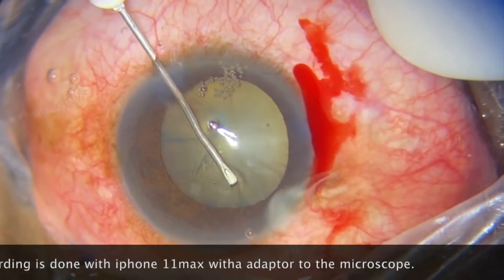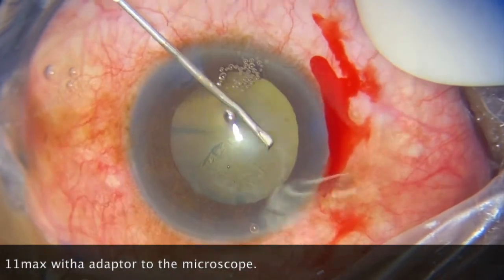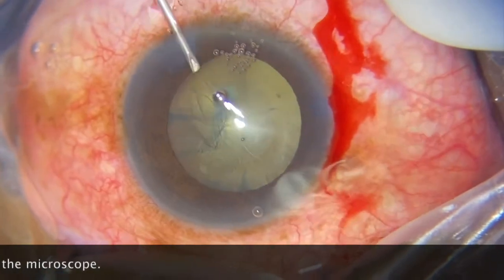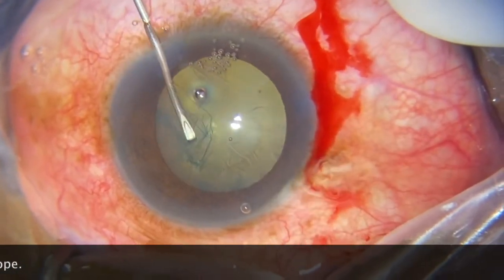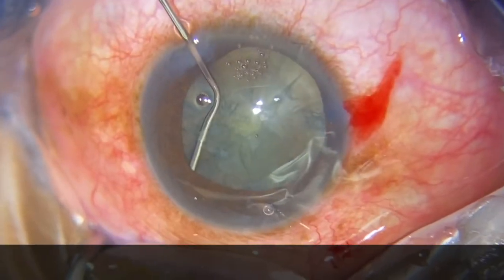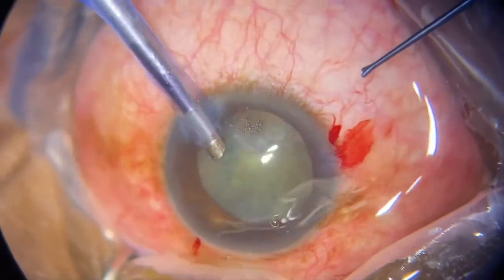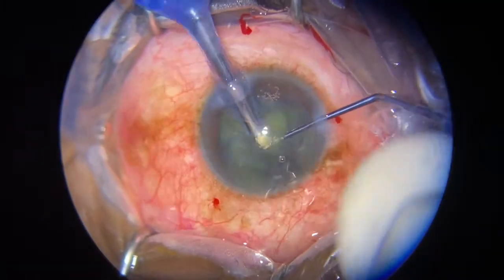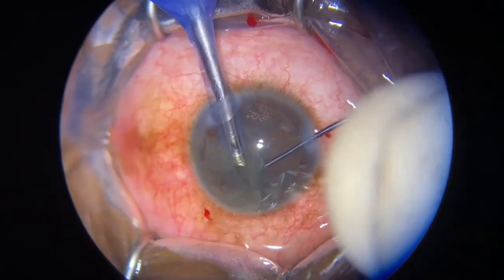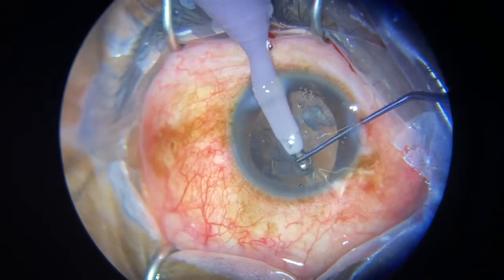This is uncomplicated retinal detachment because there's hardly any noticeable PVR. My judgment to determine whether I need an encycling band in combination with the normal vitrectomy would depend on the degree of PVR, the location of the break, the number of breaks and how far they are apart from each other. Also, if I am not able to locate the break during pre-op assessment, that will mean that I have to put an encycling band.